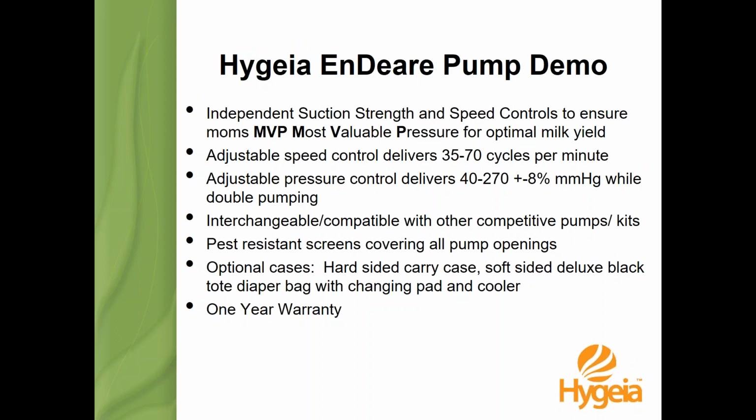Right. This is the last important piece of the personal accessory set that I want to show you. There's 2 of them here. Okay. So I've unscrewed my bottle. So what I'm going to do is I'm going to put this on. So this is a wide mouth bottle. Any wide mouth nipple out there in the market should work with this. By putting this ring on, we now have a standard bottle adapter.